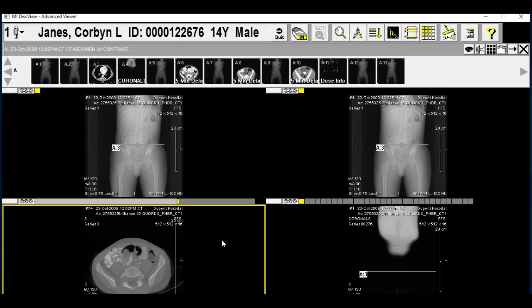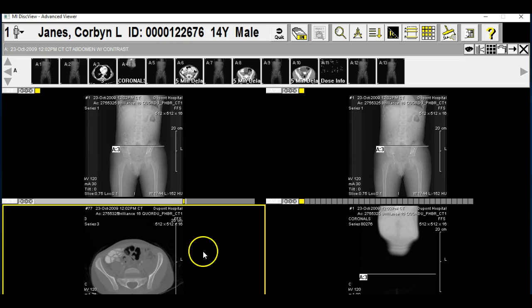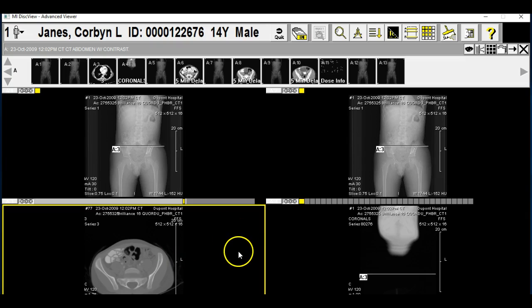Then we get into the smaller intestines. There's the bladder — underneath the smaller intestines, there's the bladder. You can see that's the bladder because there's black in it, and that's because there's urine in the bladder.